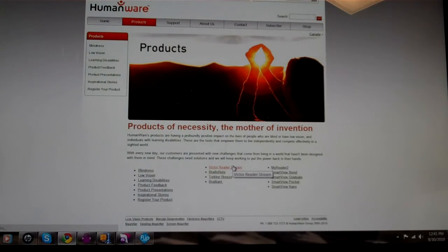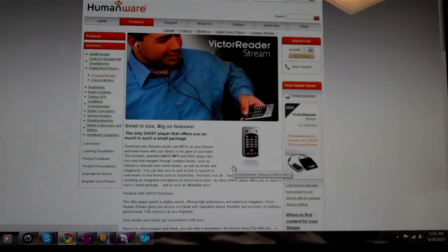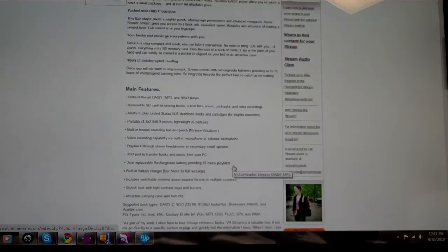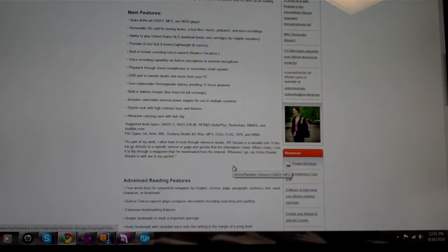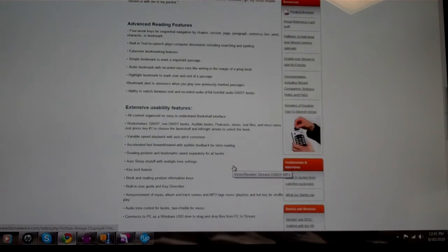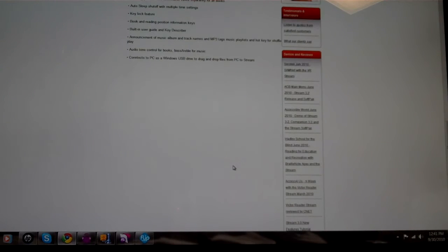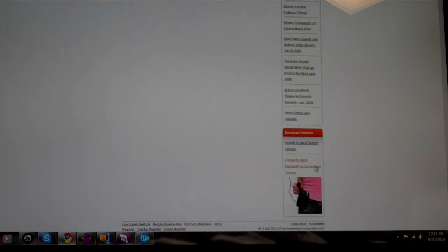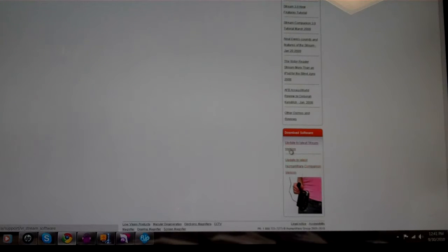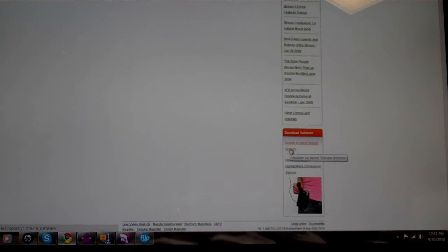And then down on your right, update. You will see update to latest stream version.